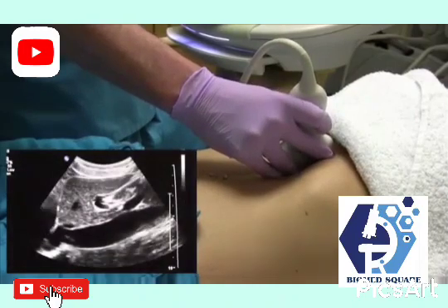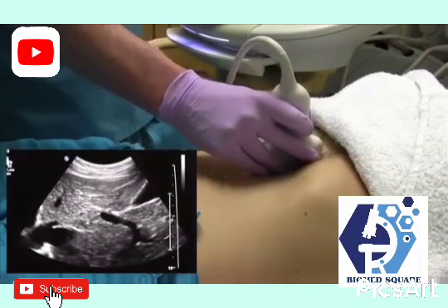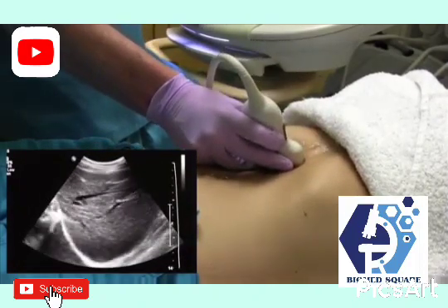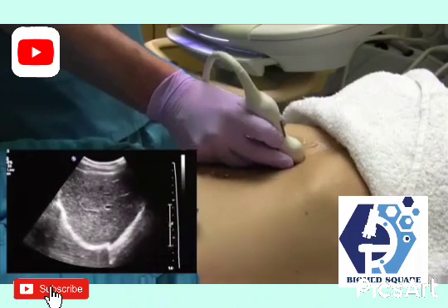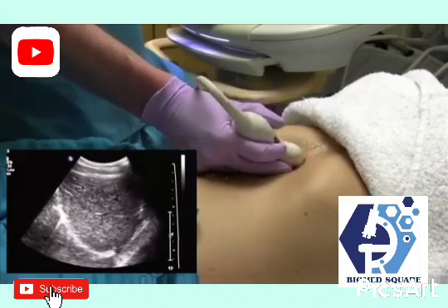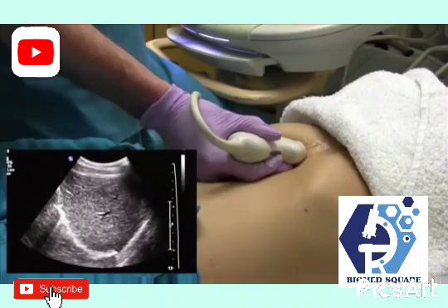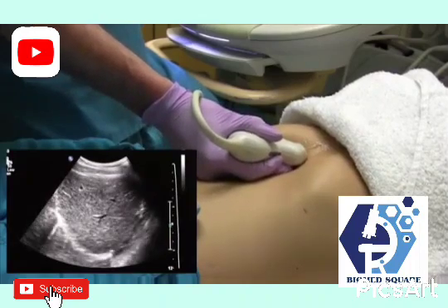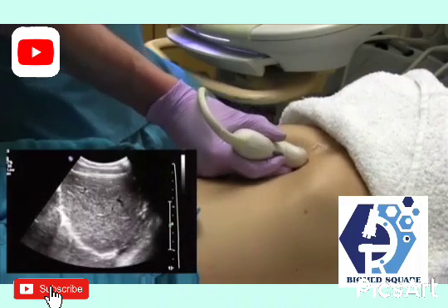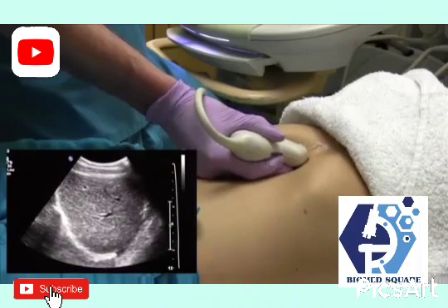From here we're going to start to come into the right lobe of the liver. And for that, I kind of follow this rib down a little bit. So it's technically, you're slightly obliqued. And what you want to make sure you do is you're pushing in and angling up underneath this rib. And what I do is I start at the dome of the right lobe and then take sequential pictures as we come down. So the first picture I get of the right lobe is just the parenchyma.